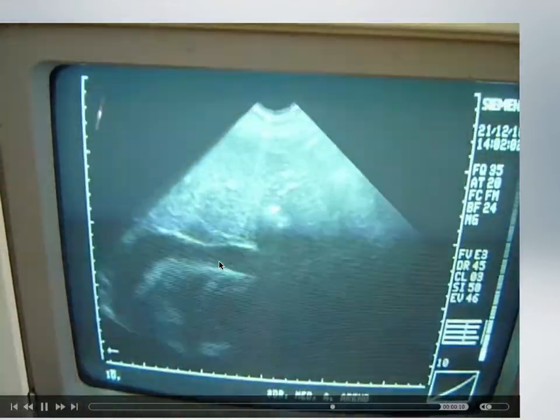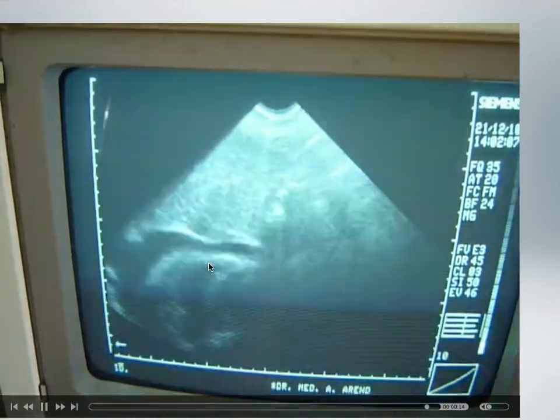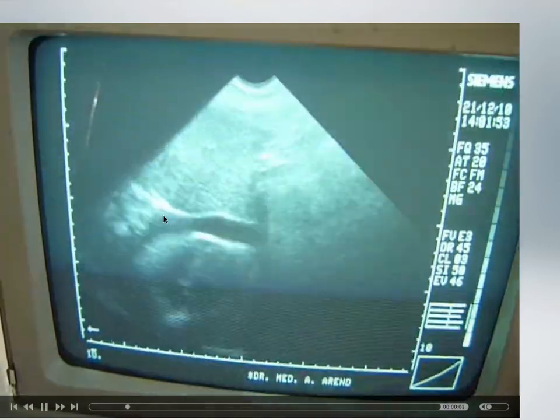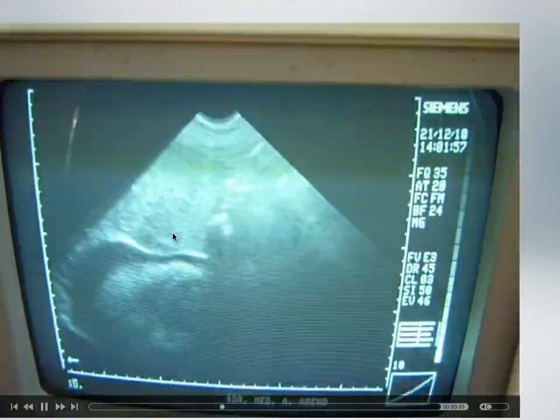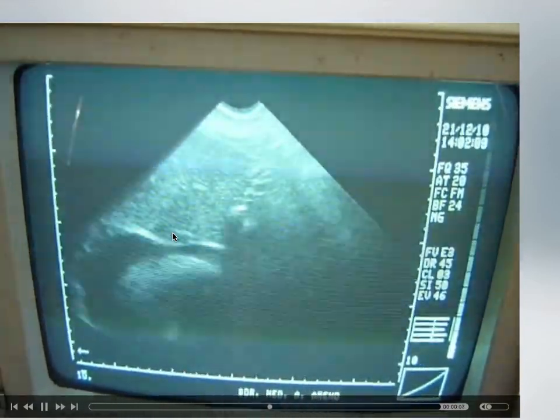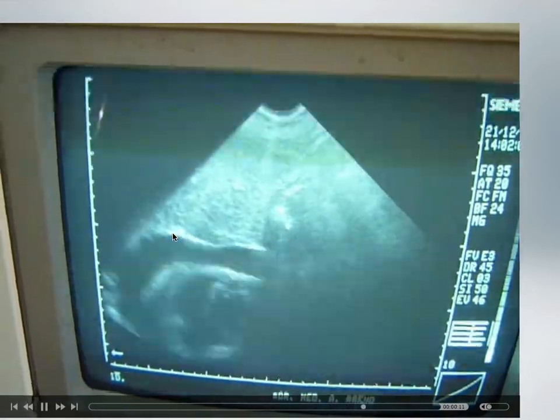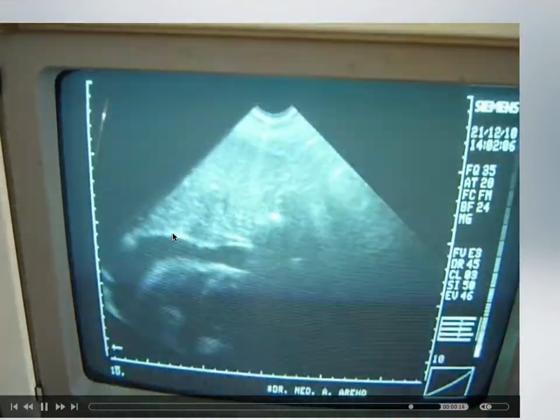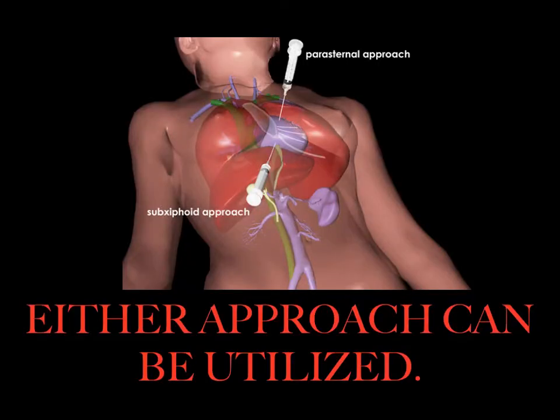And here's the heart, septum over here. And you can see some diastolic collapses. The heart is swinging back and forth inside this large effusion. So this patient's shortness of breath was more than likely not due to her asthma being kicked up by the harmattan or the sands, but it was due to her renal disease causing a very large pericardial effusion and tamponade.